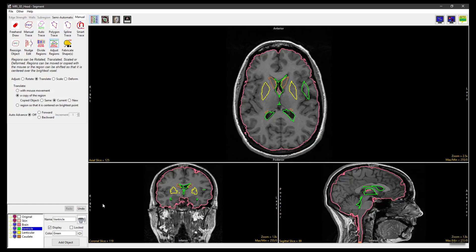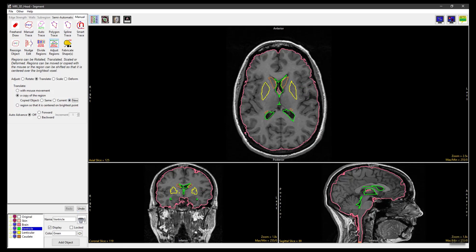Click Undo and set Copied Object to New. This will assign voxels in the new region to a new object, which is shown as a blue object in the controls panel. Again, click Undo.